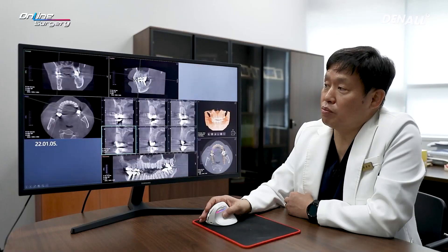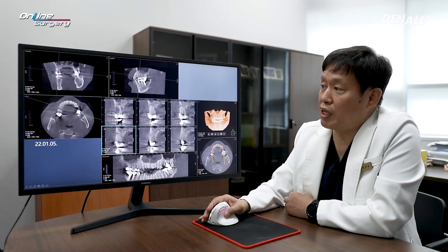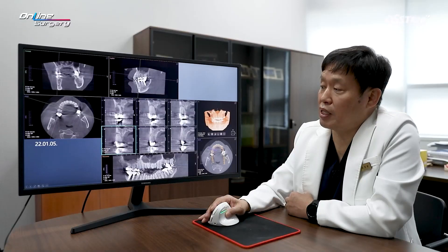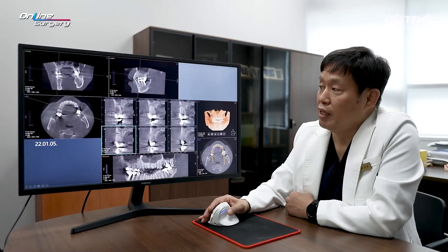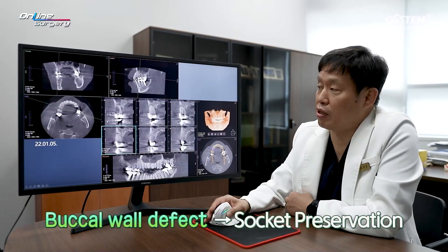This is the CT at the time of patient visit in January. In number 15, the buccal wall is completely destroyed. Along with the apical lesion, the palatal wall is also destroyed, so there is very little wall left. It is difficult to do immediate implant placement because the buccal wall is completely gone. Socket preservation was planned.